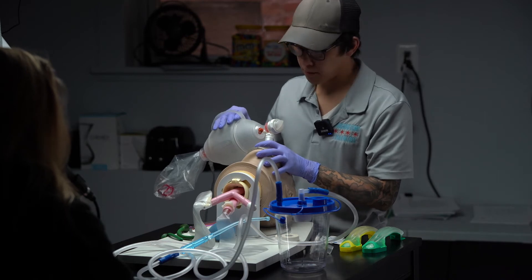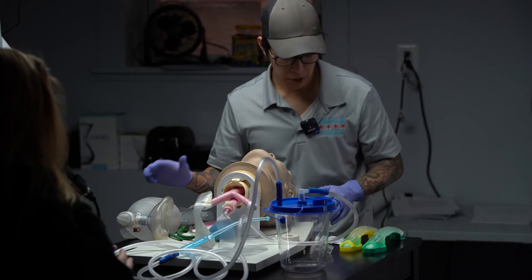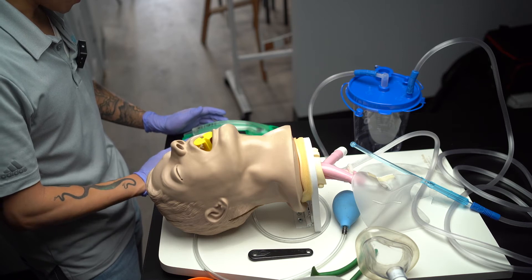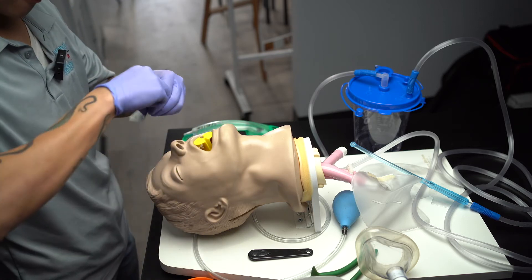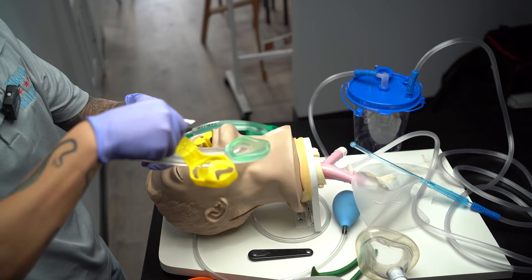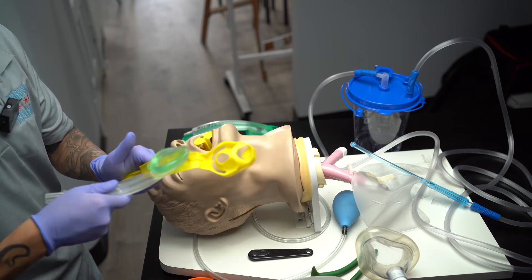I'm going to hand this off and ask my partner to continue ventilating at the same rate, one breath every five to six seconds, while I check the i-gel sizing. Can you tell me approximately how much the patient weighs? The patient weighs about 110 pounds. I'm going to convert that to kilograms: 110 divided by 2 is about 55 kilos, so I'm going to opt for the size three, which is for patients between 30 and 60 kilos. I'm going to prepare a packet of lube and lubricate the backside of the i-gel.